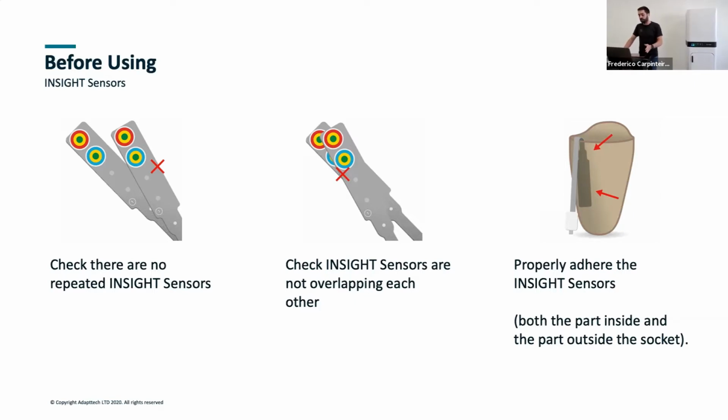And make sure that the sensors properly adhere to the walls of the socket to make sure that you have the best 3D model possible once you do the scanning, and the best location for the sensors as well.